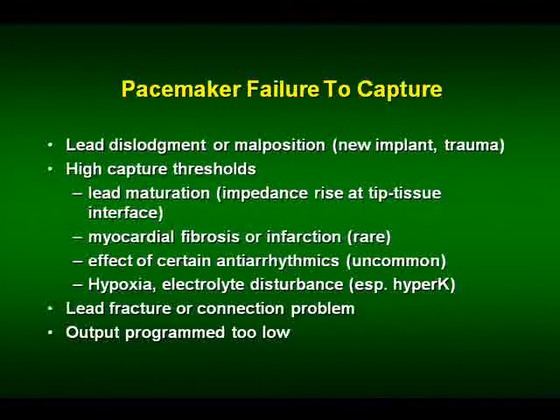Well, suppose you see a failure to capture. And all I'm saying now applies to both temporary pacemakers and permanent pacemakers. If you fail to capture, did the lead dislodge or get malpositioned? And this can happen with new implants, temporary wires. Trauma can dislodge a pacing lead. You can have high capture thresholds. There's scarring that occurs around the lead tip. We call it maturation. Myocardial infarction can do it, even though that's quite rare.